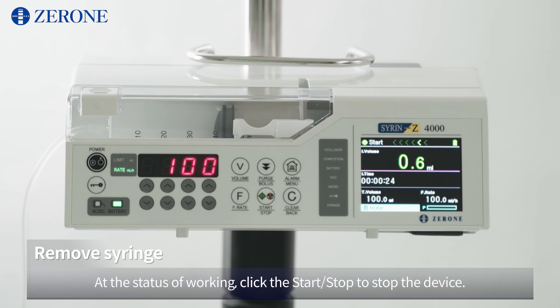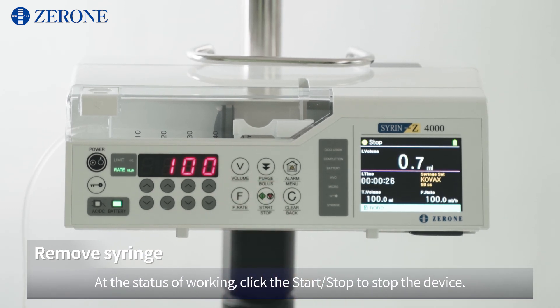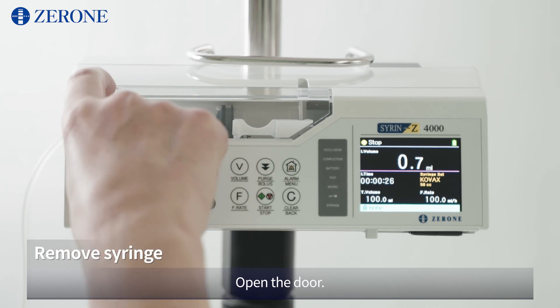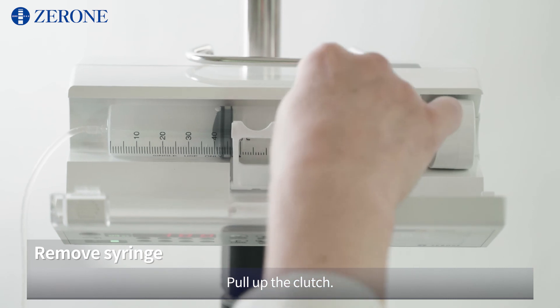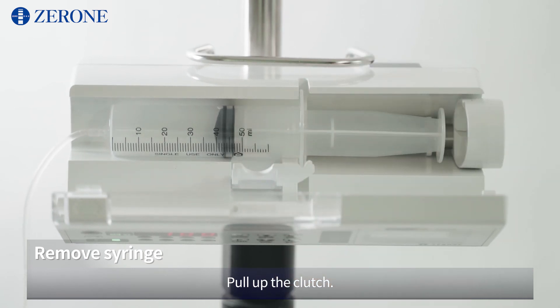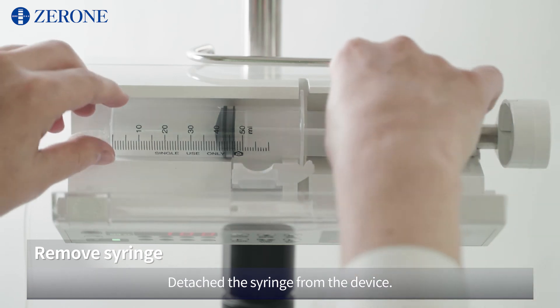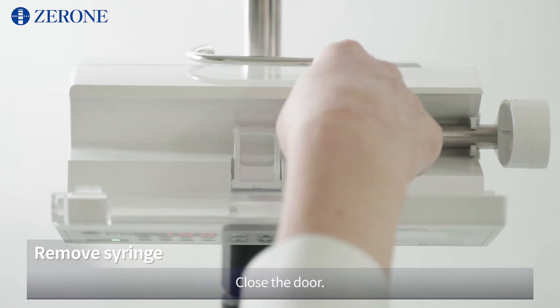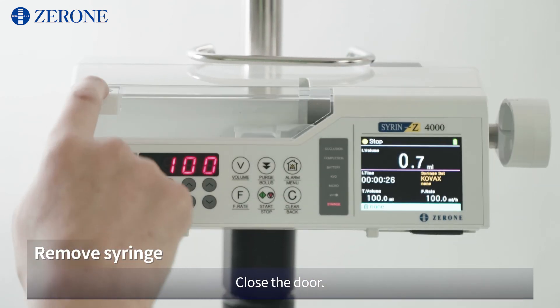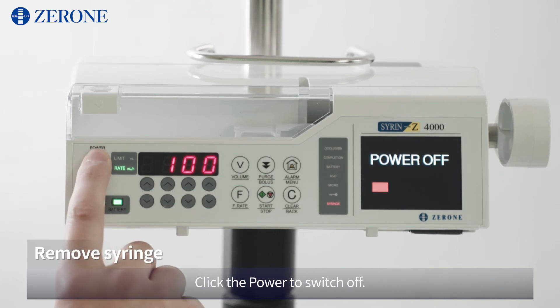At the status of working, click Start/Stop to stop the device. Open the door. Pull up the clutch. Detach the syringe from the device. Close the door. Click the power button to switch off.